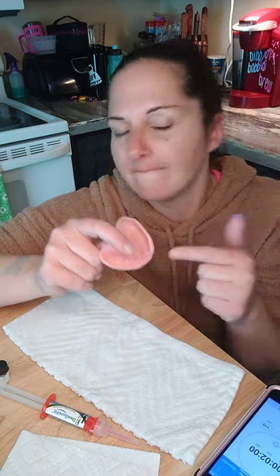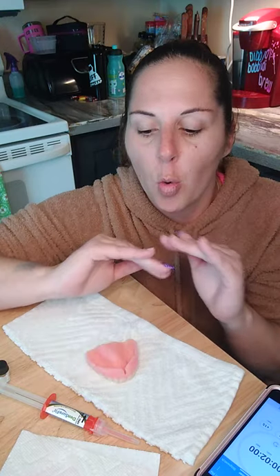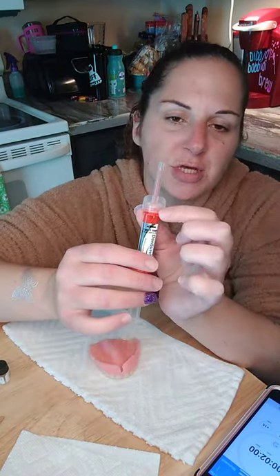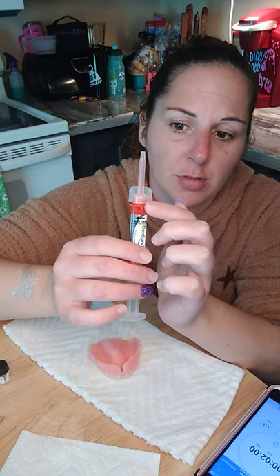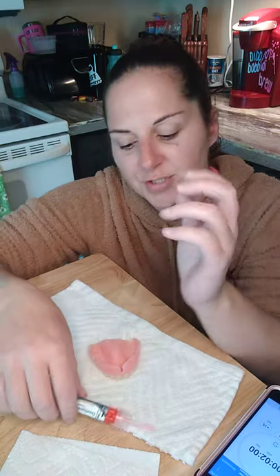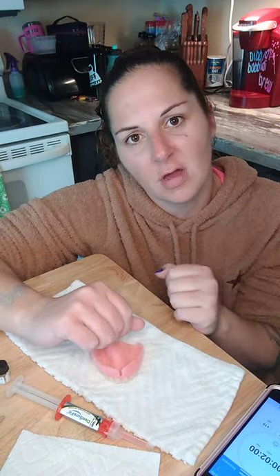So first, again, make sure your denture is super clean and 100% dried, guys. Do not twist or turn this when you're ready to do so. Don't, because once you hear that click and it's ready to go, once it goes on here, you have 15 seconds to get it into your mouth.